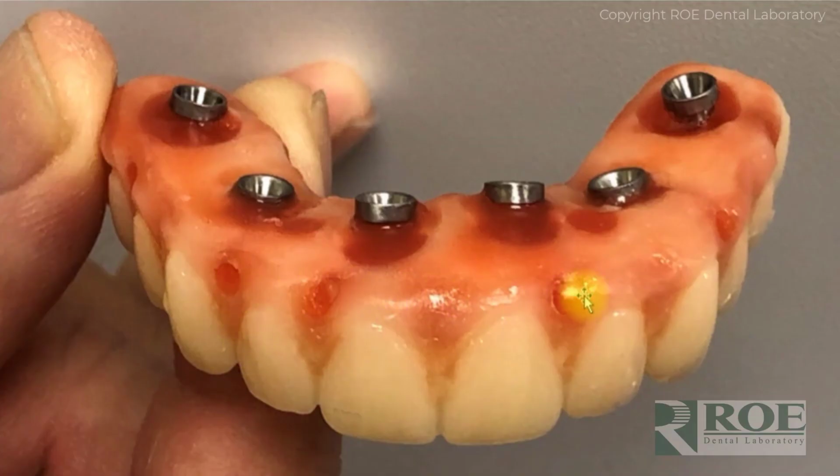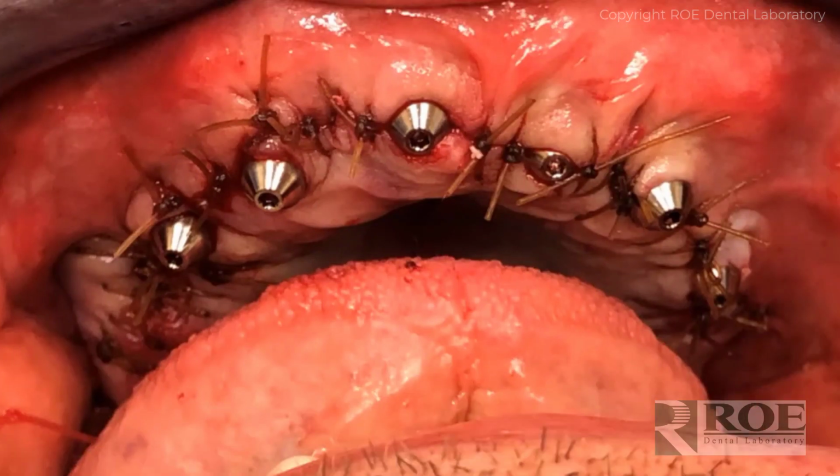And you also have to clean the ports up. I mean, this is obviously the most aesthetic part of the prosthetic. And you don't have to inject when the patient's closed. You can pick up from the occlusal while the patient's open because occlusion has already been taken into account. However, that's our recommendation. Doctors use different techniques for seating the prosthetic.